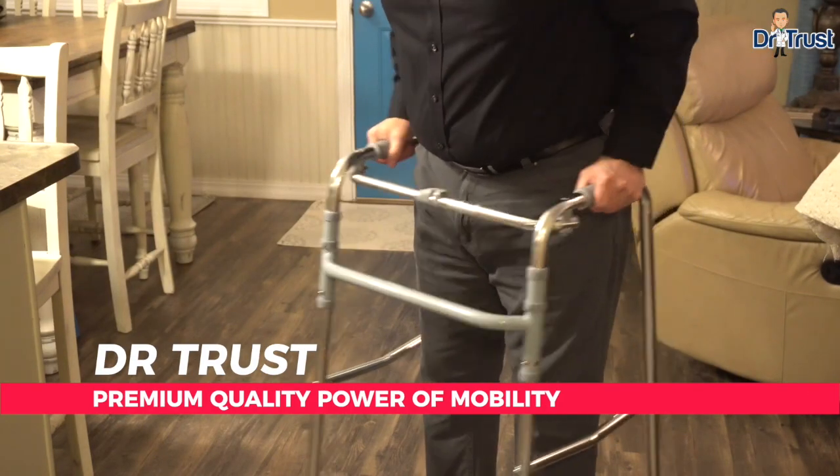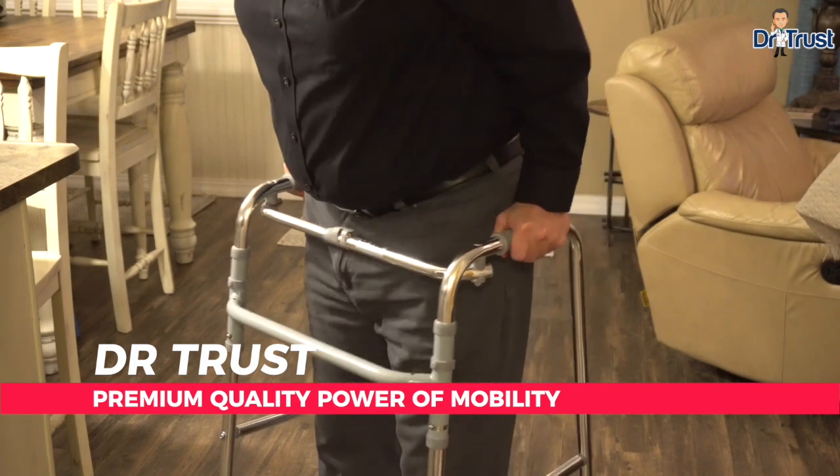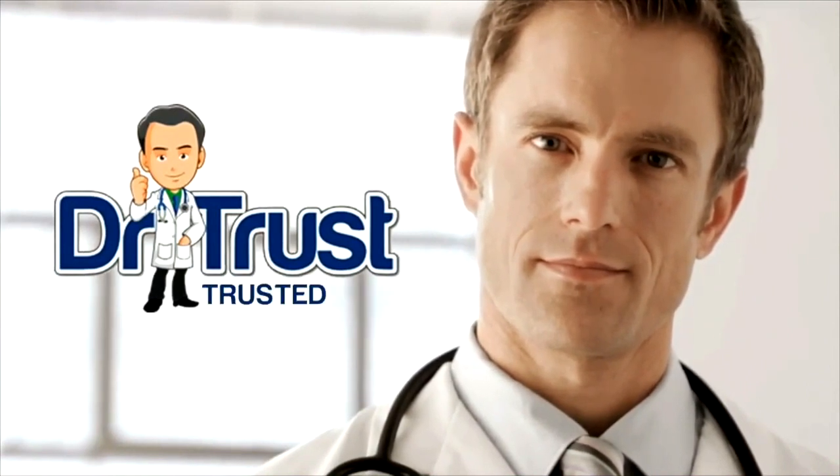Dr. Trust Walker, the premium quality power of mobility. Dr. Trust, trusted for life.